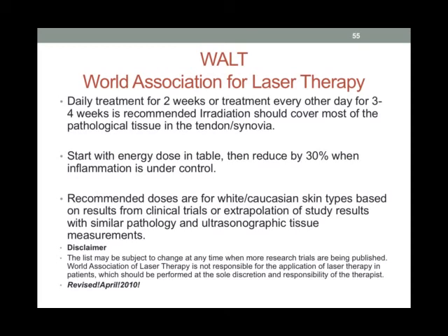And again, laser is a light beam, and when it's passing through different tissues, and through different things in the tissues, it may not pass as well. We all know that some skins will block the light more. So if you're treating somebody with white or Caucasian skin types, you can use those recommendations.